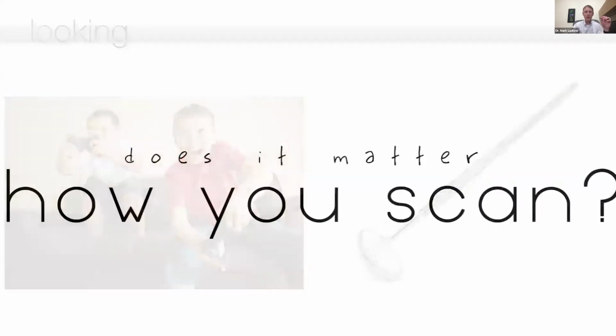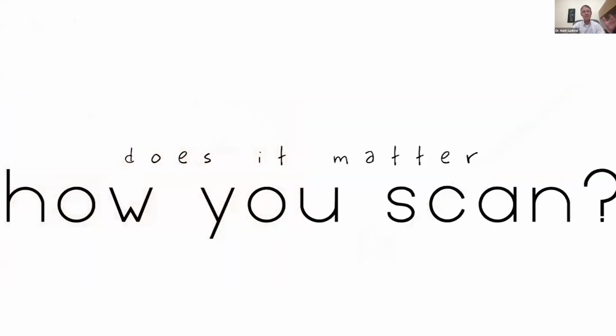The final thing which we'll kind of look at is this: does it really matter how you scan? This has been kind of a labor of love from a data perspective with my colleagues and I, because when we first started looking into this, we'd call up companies and say, hey, how do you scan? And they'd say, well, I just kind of go like this, wave it around a couple times, and boom, you got a model. But you have to realize how these things work, and the accuracy of scanners come from two things. One, they come from the hardware that is in your scanner.